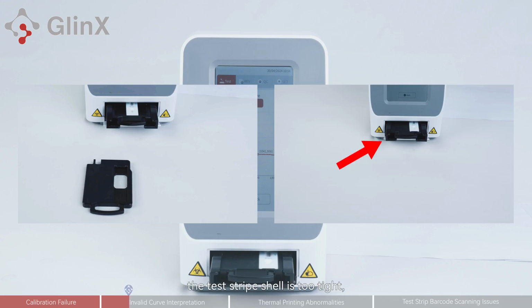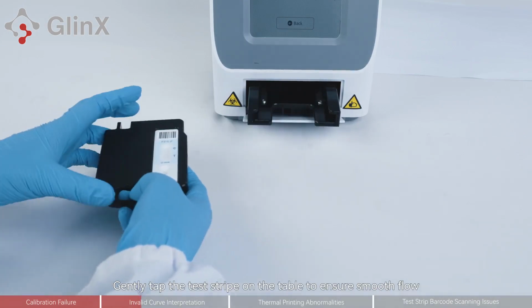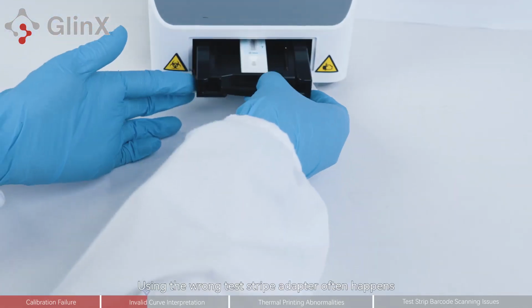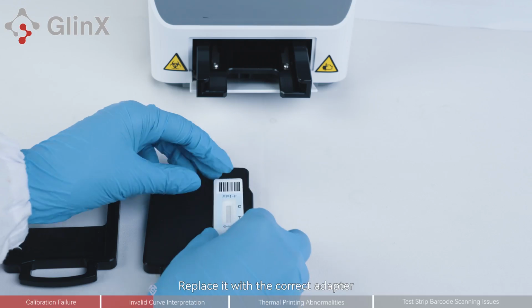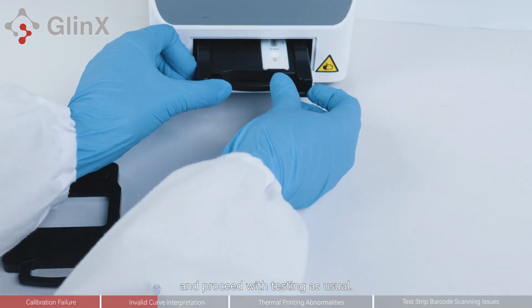The test strip shell is too tight, preventing the sample from reacting with the reagent strip, or using the incorrect test strip adapter. A too tight test strip shell can hinder liquid flow. Gently tap the test strip on the table to ensure smooth flow of the liquid before placing it into the test strip adapter for testing. Using the wrong test strip adapter often happens when the multi-test strip adapter is used for a single test. Replace it with the correct adapter and proceed with the testing as usual.